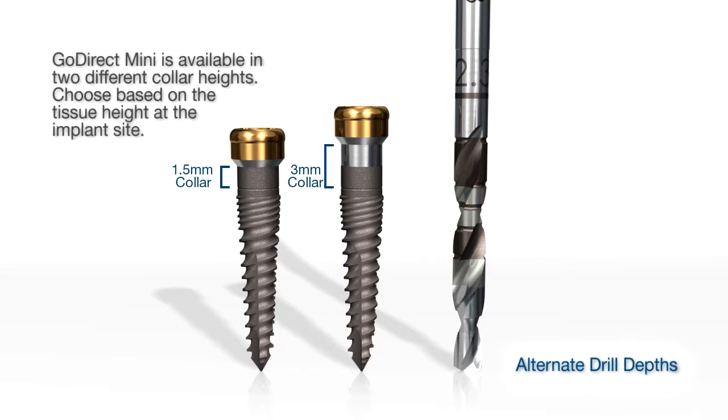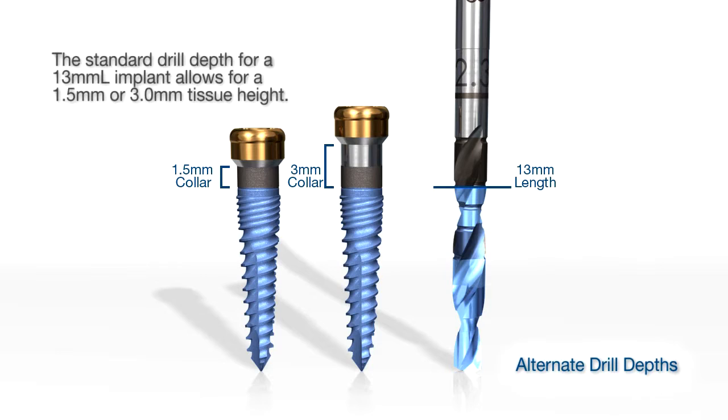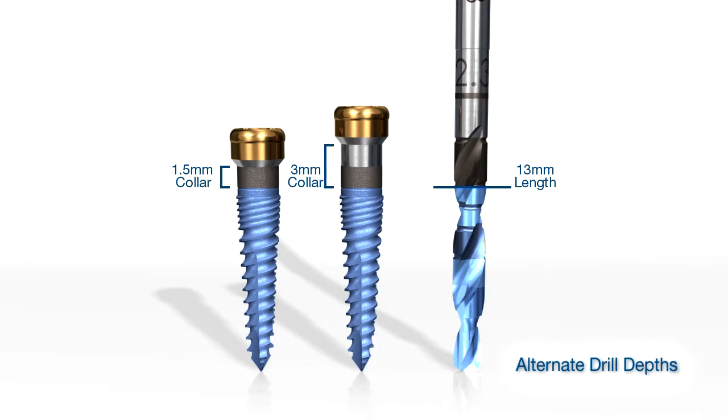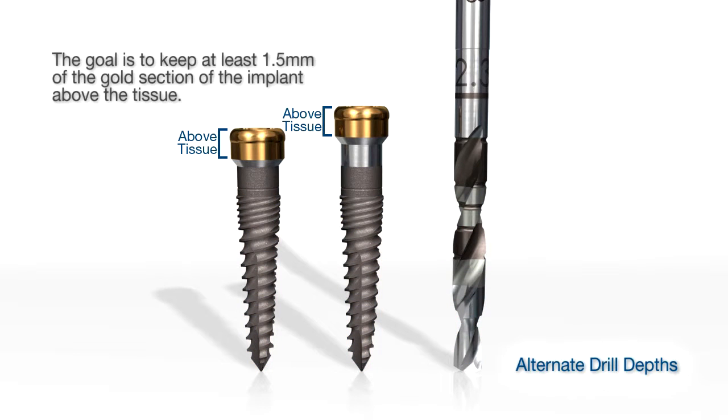You see there are two neck lengths, 1.5 and 3 millimeters. That's 13. This would be to the 14.5, which is halfway between 13 and 16. And this 1.5 millimeters must stick above the soft tissue for the attachment to snap on.